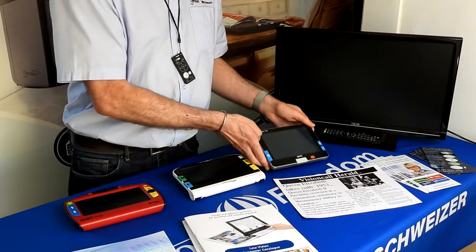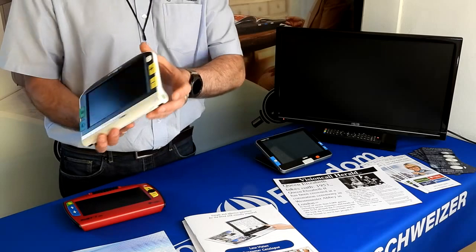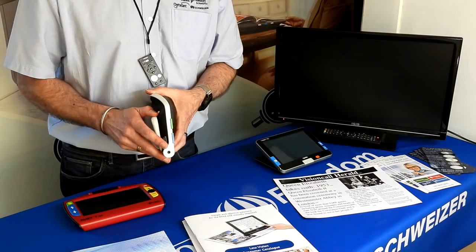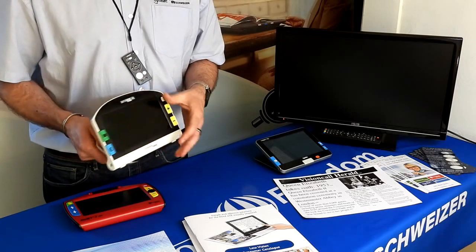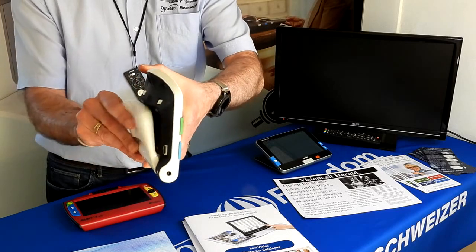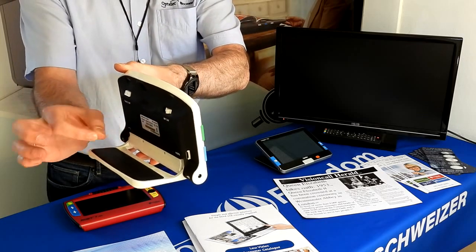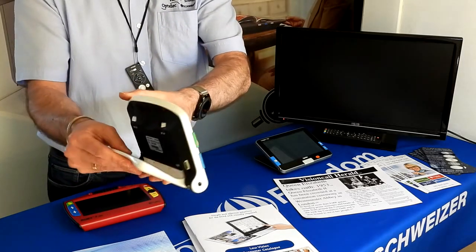For those who prefer something lighter, we have the Amigo. It has a power button on the side to turn the machine on and off. The battery life in all the machines is roughly four hours of continuous use and takes roughly 90 to 120 minutes for a full recharge. It also has the same clamshell design, with the extra benefit that it can open even wider, making it easier to write underneath or work with tasks like threading needles.